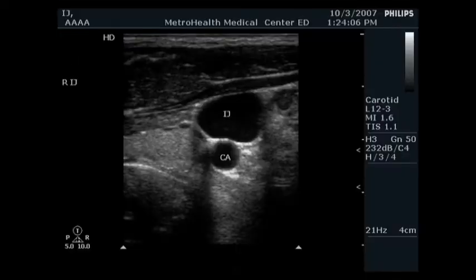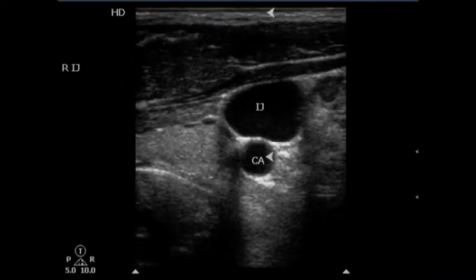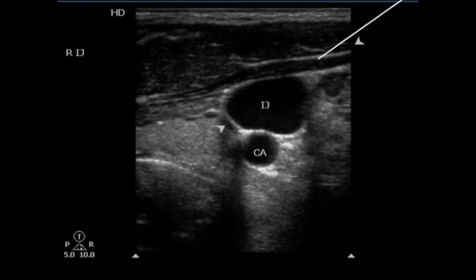In this second illustration, the carotid artery is immediately posterior to the internal jugular vein. Here you can see using the middle approach might be a problem, as we could go directly into the carotid. If we use the posterior approach, as in this view, no harm will happen.